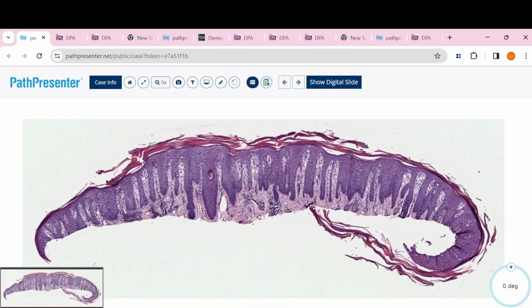First, this is conventional, regular psoriasis. So we can see this confluent parakeratosis. That means in most of the lesion we can see parakeratosis here. Then under this parakeratosis you can see the granular cell layer diminished. Usually we will see a little bit of purplish color in the granular layer, but in psoriasis under the parakeratosis you cannot see a really clear purplish area.